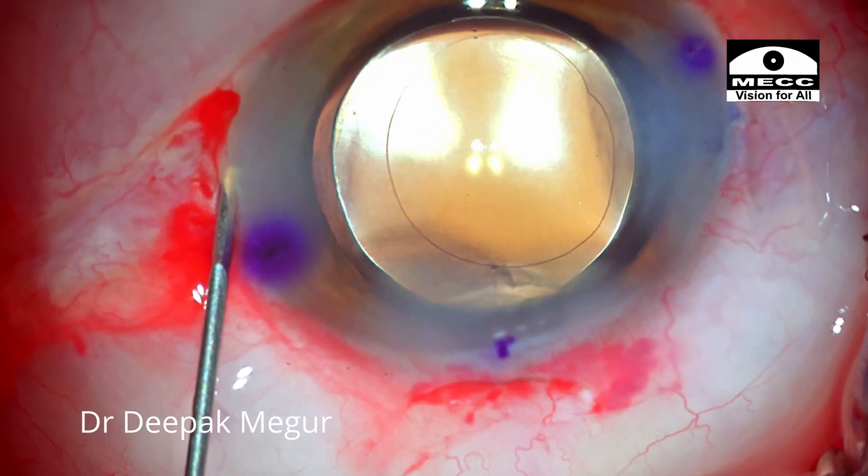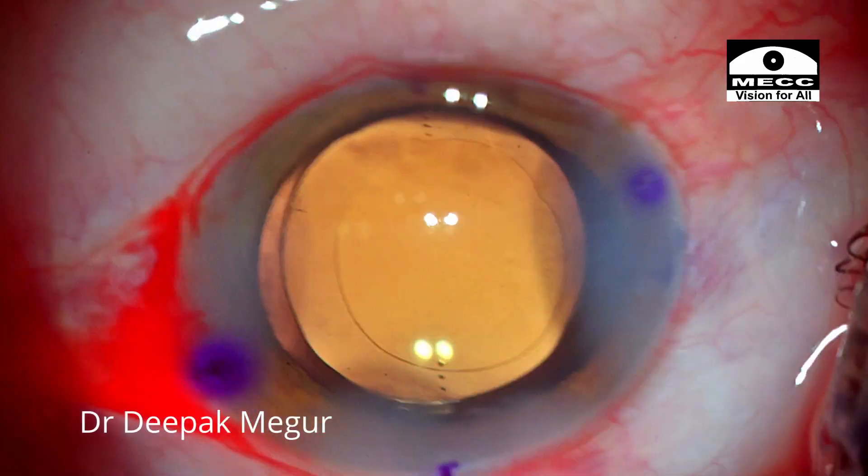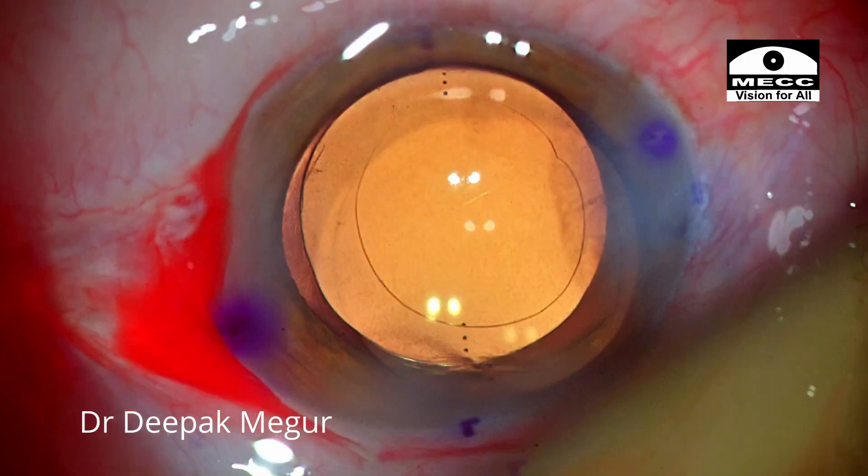Hydration of the wounds is done. I wait for a minute just to ensure that the IOL remains on its intended axis. That's it — the case is done, and now is the time for the results.